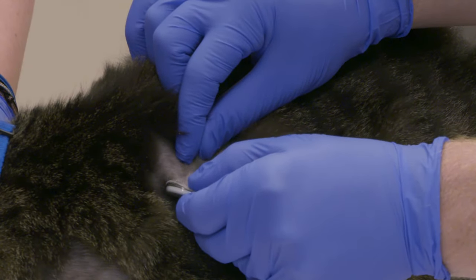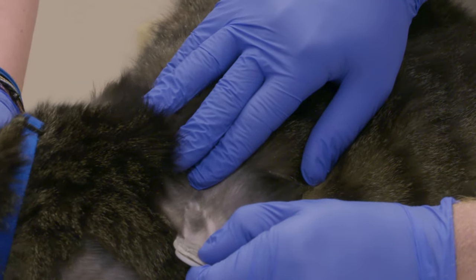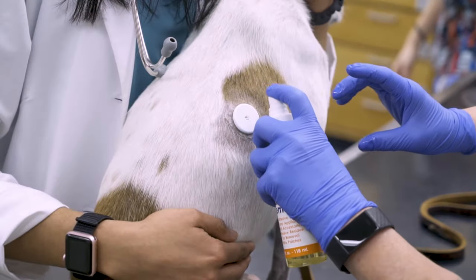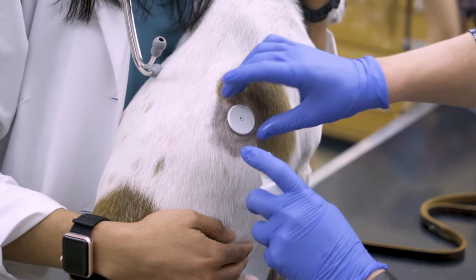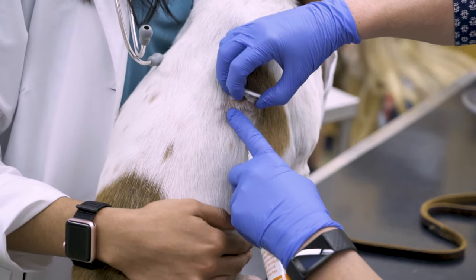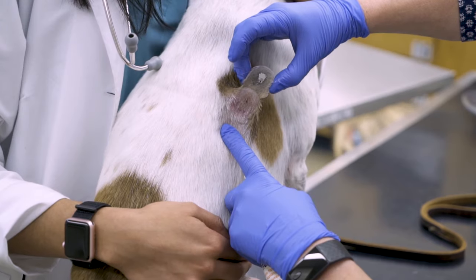Once the sensor has recorded data for 14 days, the reader indicates that the sensor is expired and it should be removed. Some sensors are easily removed by gently peeling from the skin, but sometimes an adhesive remover solution is required to remove the disc if it is closely adhered to the skin.